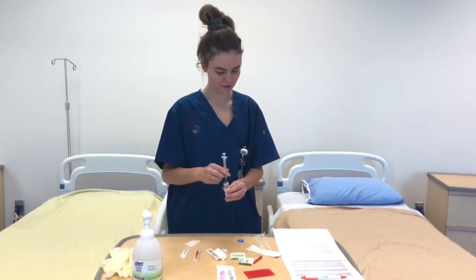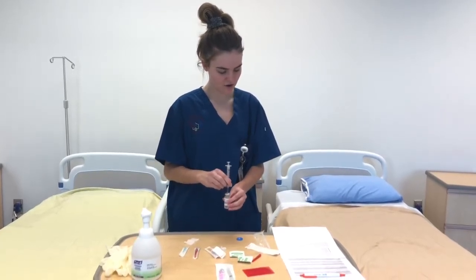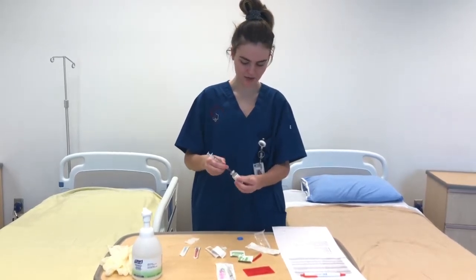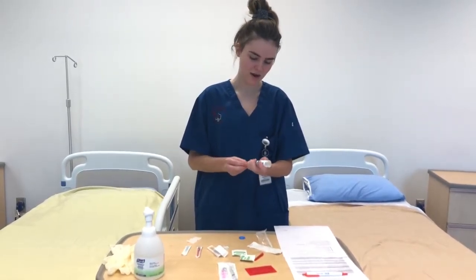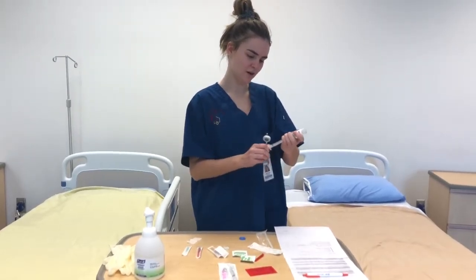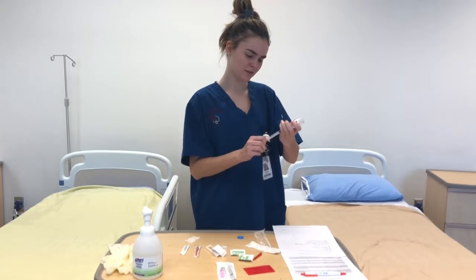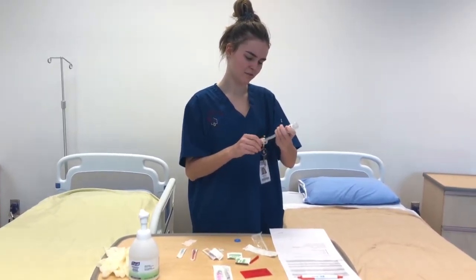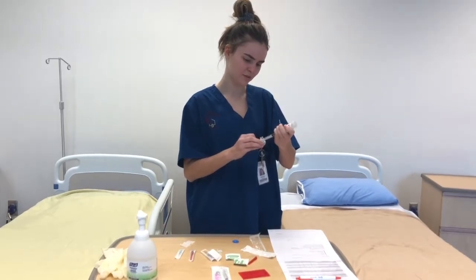And under Mr. Mancini's medication orders, we are going to be giving him 1 milliliter of heparin subcutaneous. So now I'm going to be doing this so that I don't get any air holes in it, and draw up 1 milliliter of heparin for Mr. Mancini.